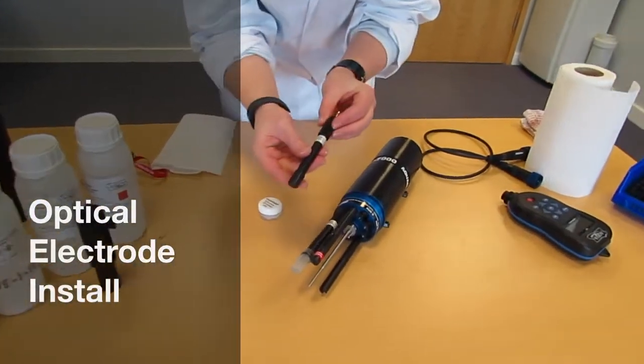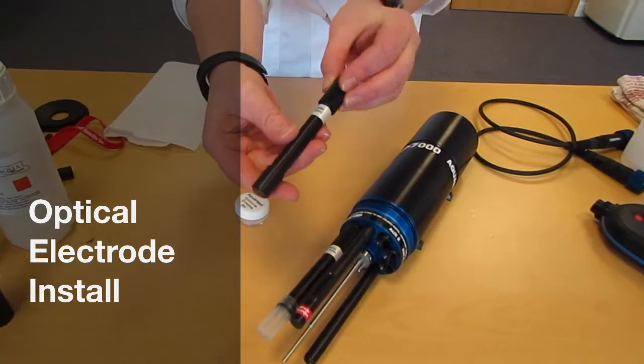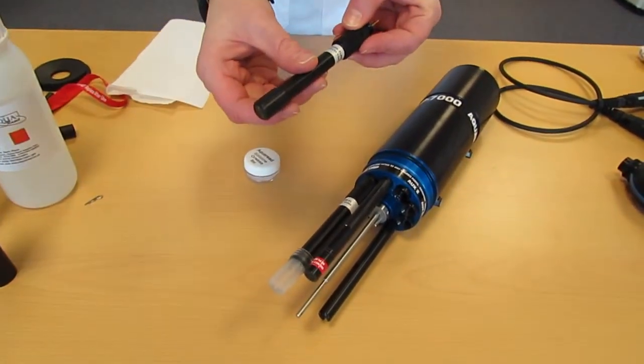Next we're going to be installing an optical electrode into the AP7000. This electrode is a turbidity electrode.